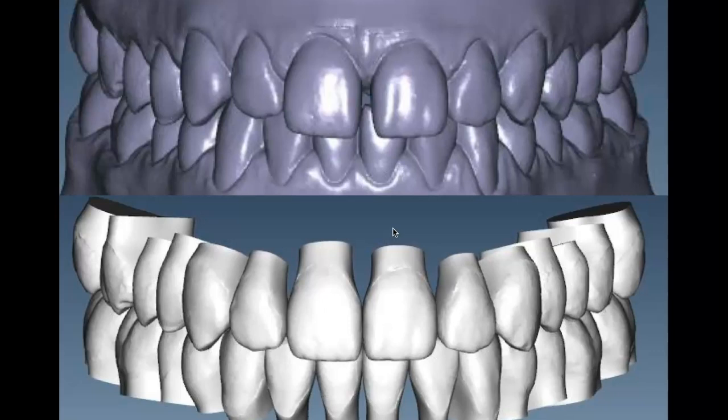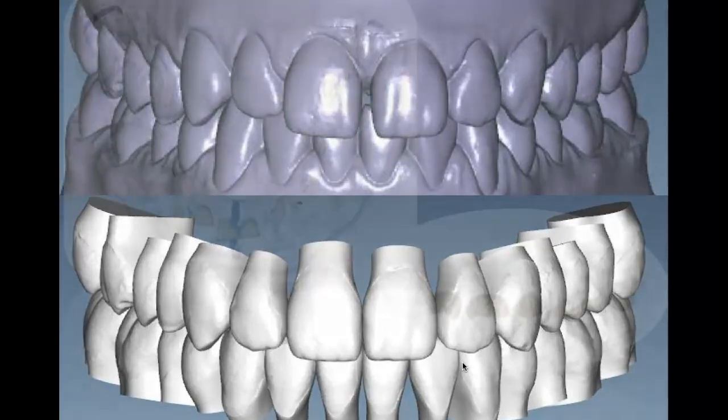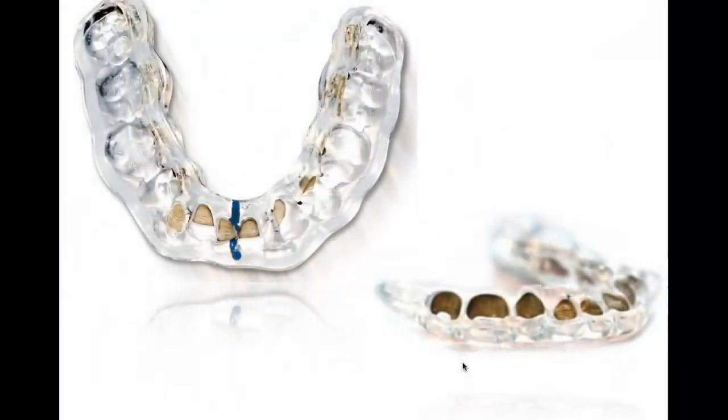A couple of things stand out to me now. I mean, look at the size differentials between the laterals. That's definitely something that I would have been talking to the patient about. You can see how the left lateral is a little bit skinnier and definitely shorter than her right lateral, sorry, her right lateral is shorter than her left lateral. Her centrals are maybe a little bit small compared to the rest of the canines there. So definitely some aesthetic options there as far as bonding or not bonding, so we'll definitely cover that with them. But these were the Incognito brackets.